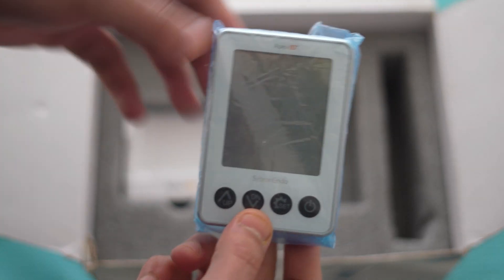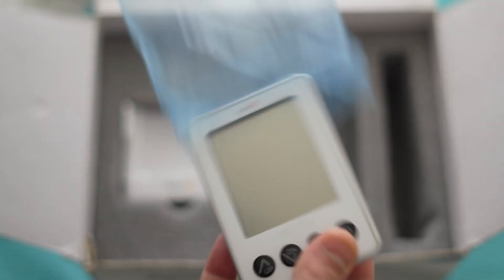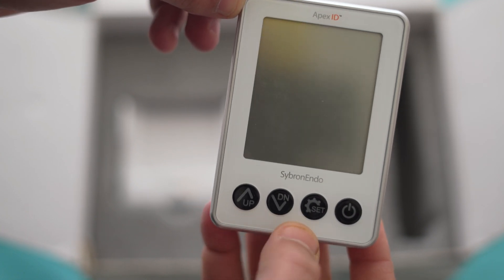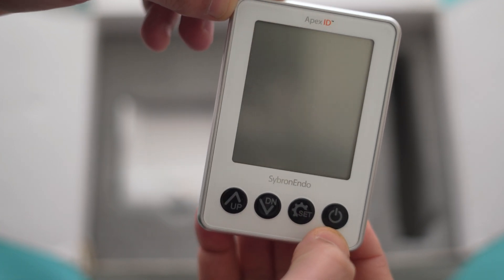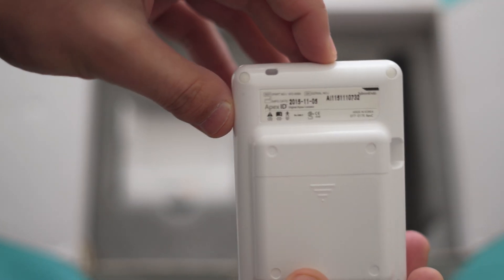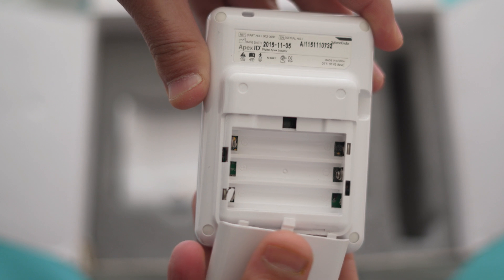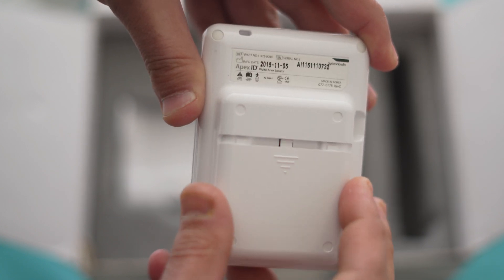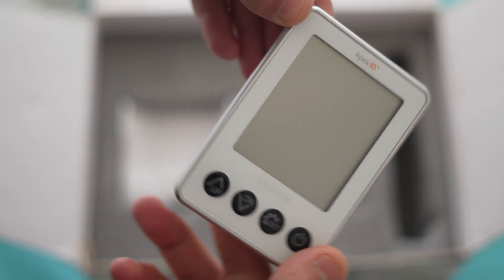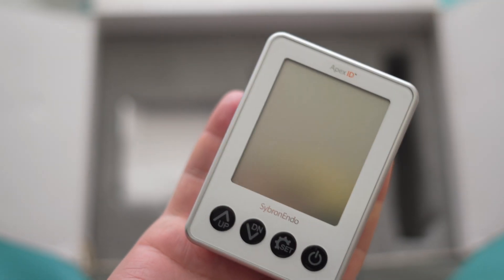Now we will come to the Apex locator itself. The design looks very cool and its color is also decent. Those are the functioning buttons — this is the setting button and this is the on/off button. On the back side is the place for battery insertion where the three batteries can be placed. Overall the design is pretty good, and the Apex locator is also light in weight. So this is the main unit.